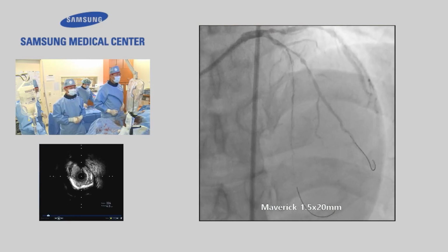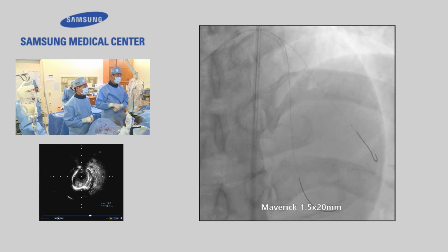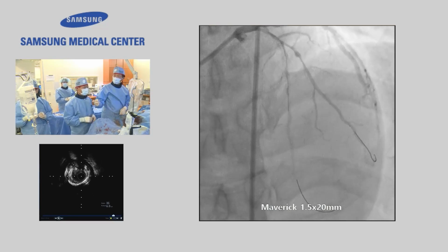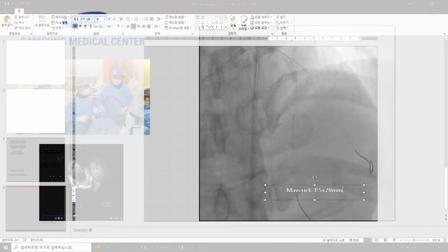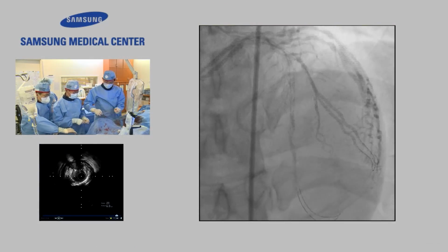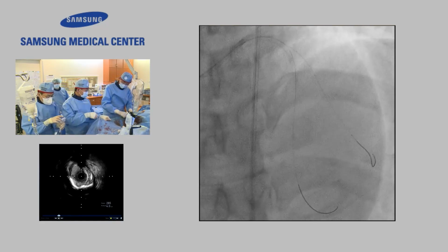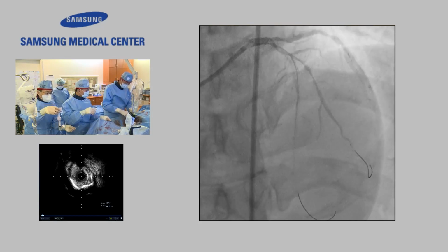Actually, there is no difference in the end between the two-stent and one-stent technique if we achieve an optimal MSA of 2.5 in both stents. The outcome of 2.5, 20 is not bad. I agree that the decision for DCB or stent should be made after larger balloon dilatation of the diagonal branch. If the post-balloon result is acceptable, you may consider DCB, but if not, straight stenting. Yes, thank you very much, Dr. Gu.